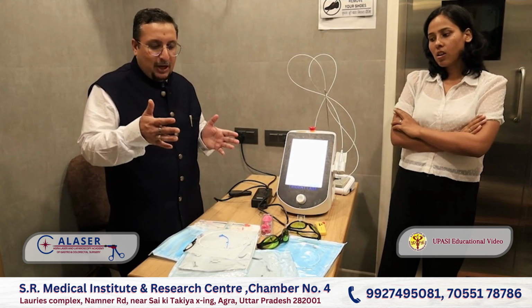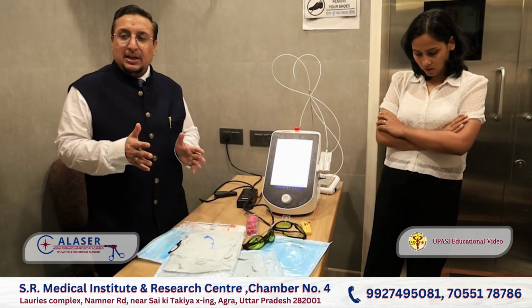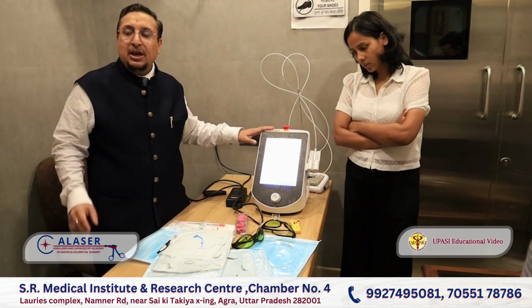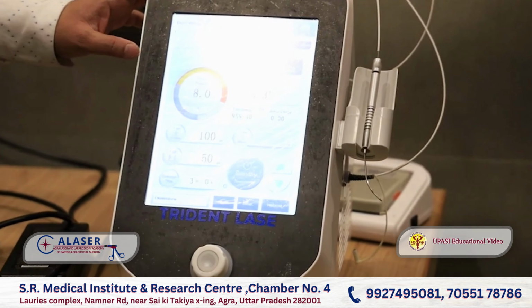So there are basically two machines. A 15 watt machine with 980 nanometer wavelength, and another is the 1470. Right? And there is some machine which is a dual wavelength. You can see it. This is dual wavelength, which machine has 980 also and 1470. You can operate with this machine at 980 nanometer wavelength also and 1470 nanometer wavelength also.